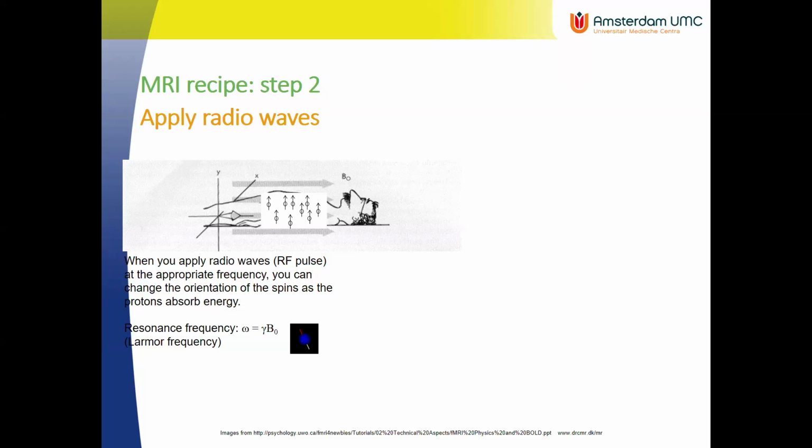To interact with the protons, with the compass needles, the radio waves need to have a certain frequency, which is called the resonance frequency. And that frequency is exactly equal to the frequency of the precessional motion.